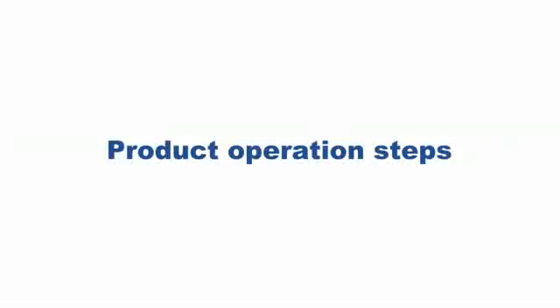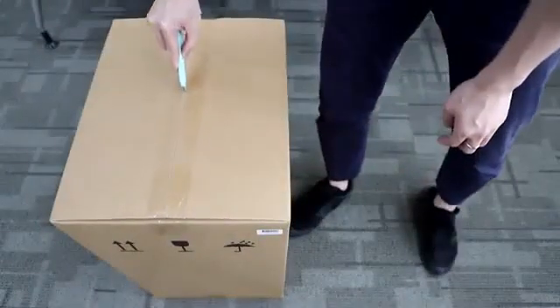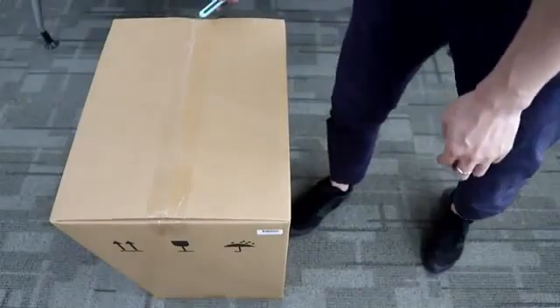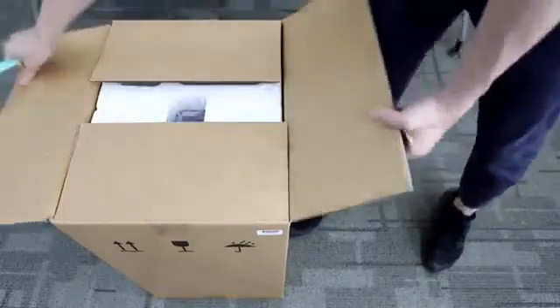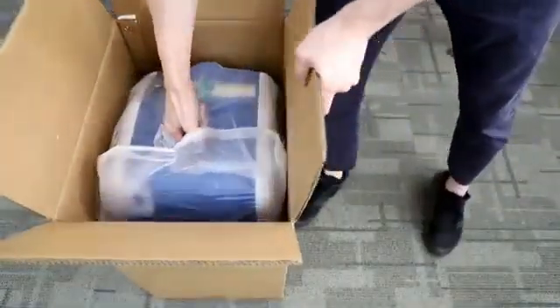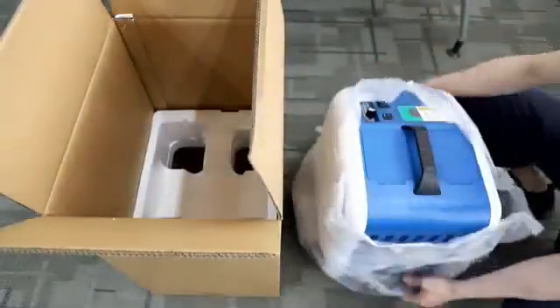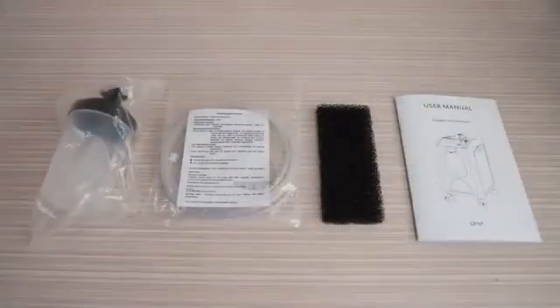Product Operation Steps. Unpack the product. Take out the product. Check the product packing accessories list.